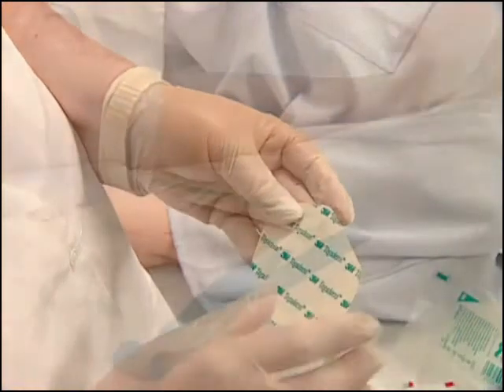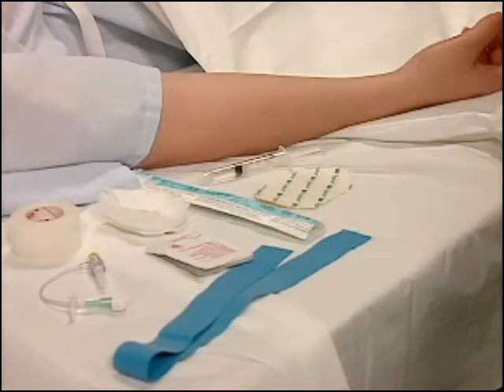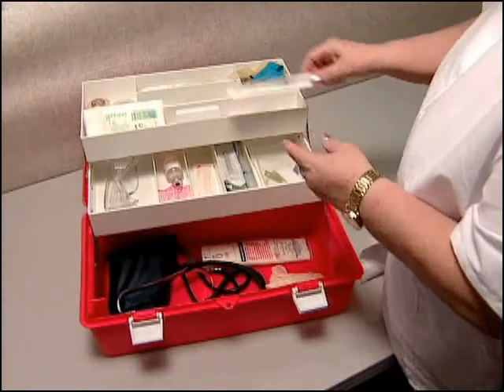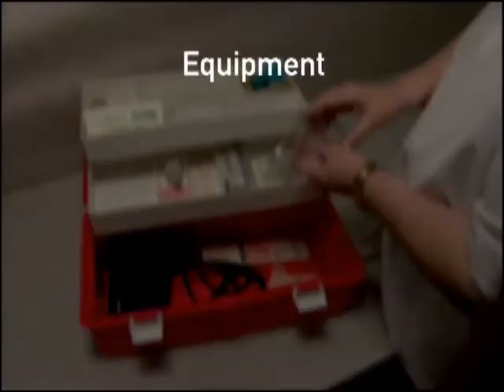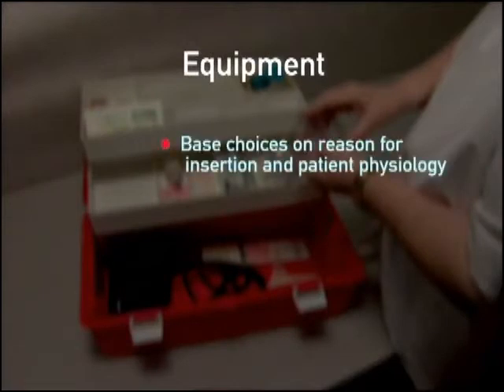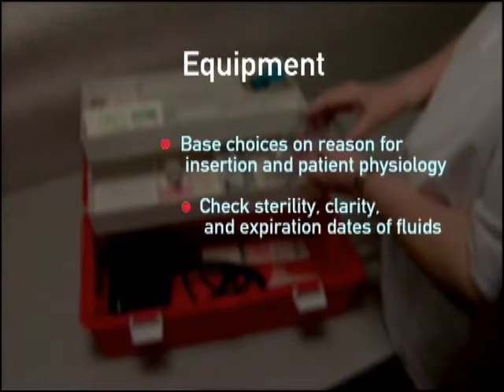After you have discussed the procedure and answered all questions, gather the necessary equipment and bring it to the patient's bedside. When selecting equipment, gather everything necessary to successfully complete the procedure. Leaving the patient's side during the process could prove detrimental to both patient and process. Sound planning and preparation will eliminate the need to interrupt the procedure to call for help or seek additional equipment.